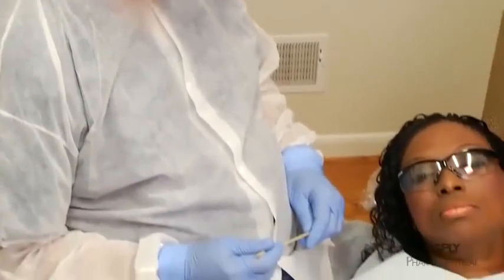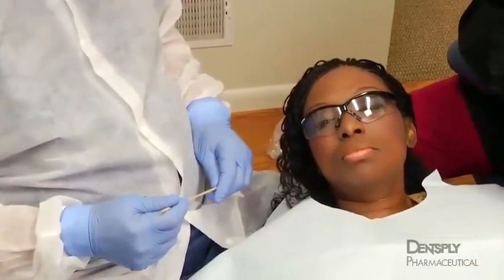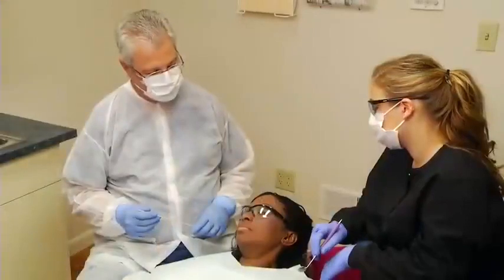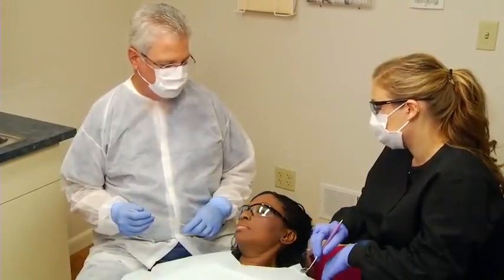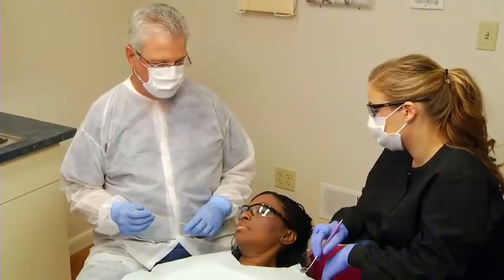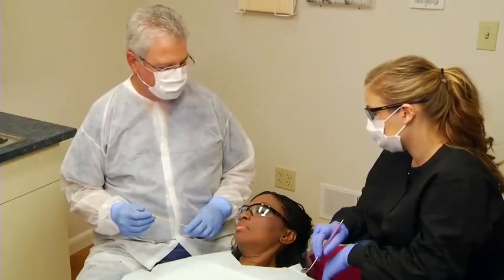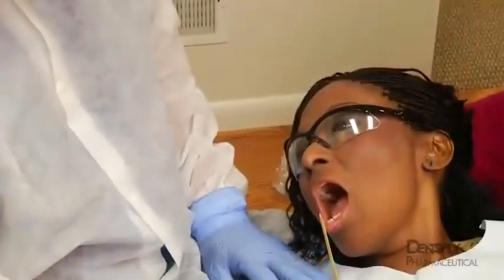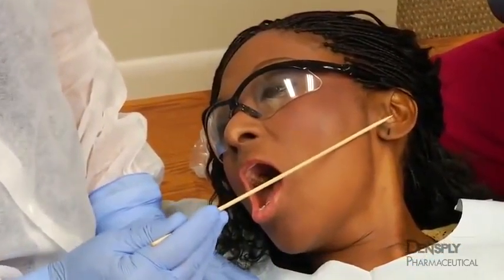The position of the operator and patient for performing a Gowgates block of the left mandible is similar to that used for the standard inferior alveolar nerve block, except that the clinician must be able to view the patient's face, in addition to the oral cavity. The Gowgates technique relies on extraoral landmarks to establish the plane of insertion. With the mouth wide open, the angles of the mouth, the lower border of the tragus, and the neck of the condyle lie in the same plane.